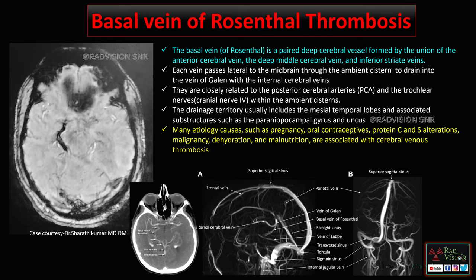Next case: this patient presented with headache and vomiting. There is a linear serpiginous vascular-like structure noted in the right ambient cistern which is showing blooming on GRE. This is a classical location of the basal vein of Rosenthal, so this is a basal vein of Rosenthal thrombosis.